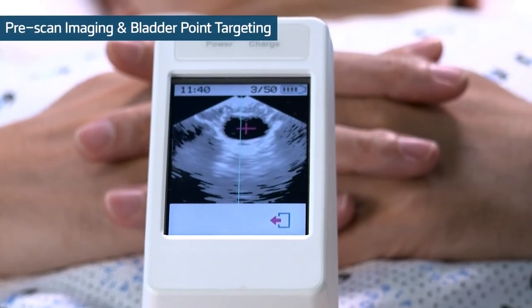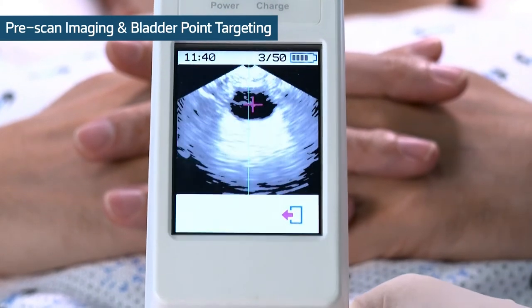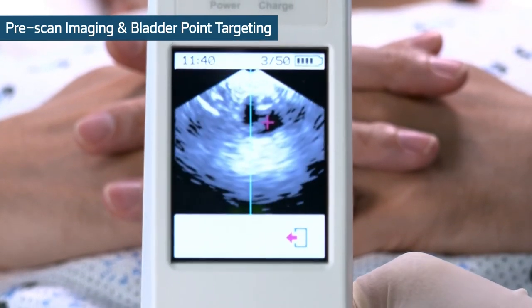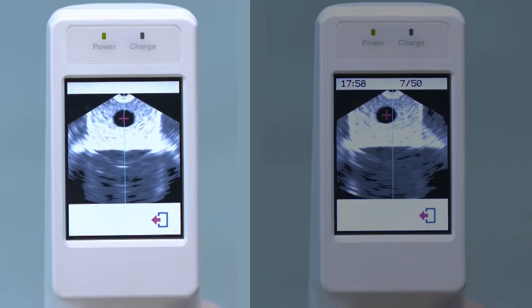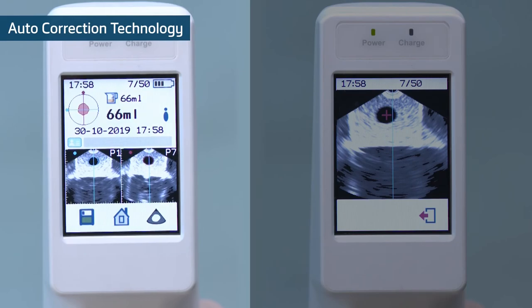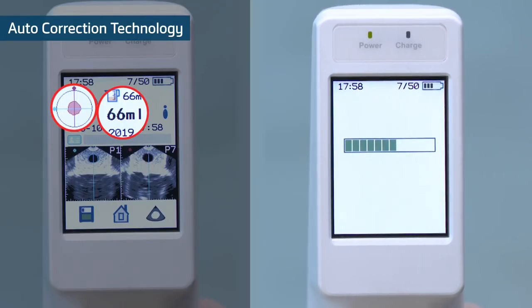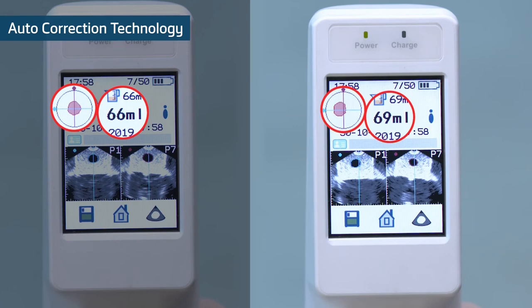Pre-scan imaging and bladder point targeting: the live image of pre-scan and bladder point leads to short scan time. Auto-correction technology: by using 3D volume estimation modeling, bladder volume is accurately calculated even in the case of off-center scans.